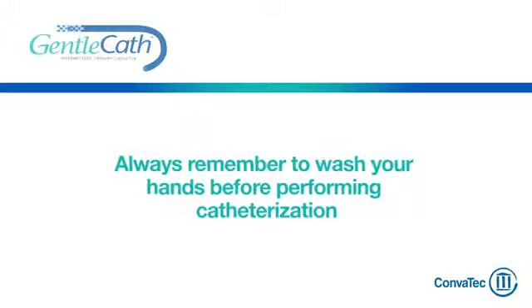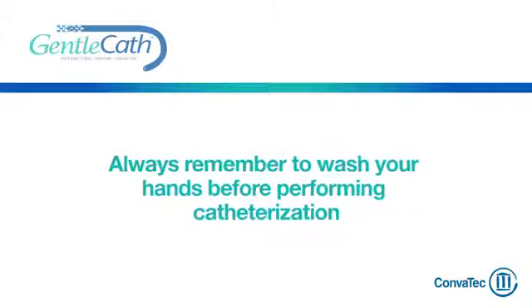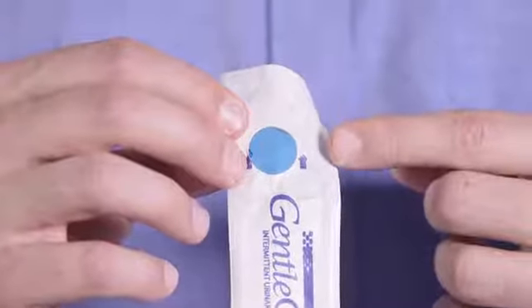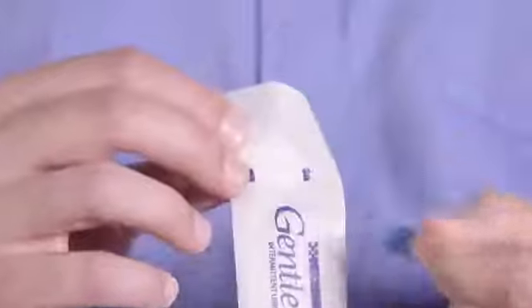Before using the catheter, make sure you have washed and disinfected your hands. You can use the blue tab on the back of the catheter packaging to stick it to a wall while you do this. The catheter will be ready to use once you are finished.